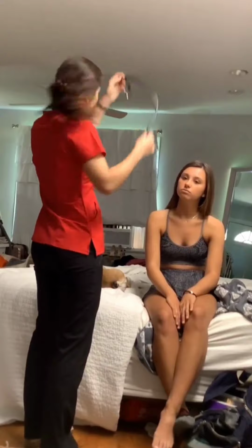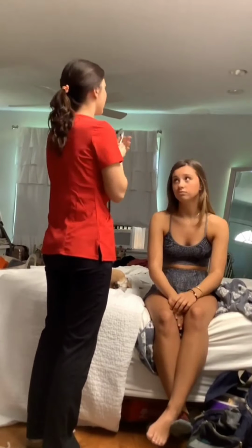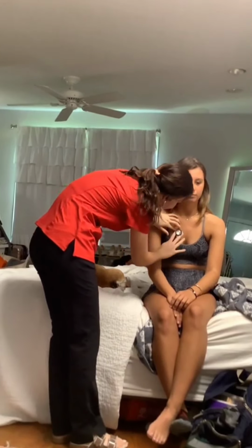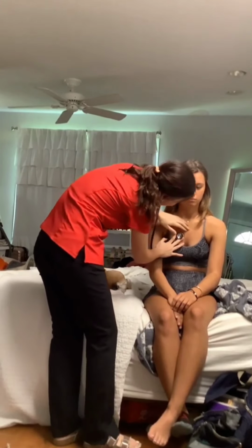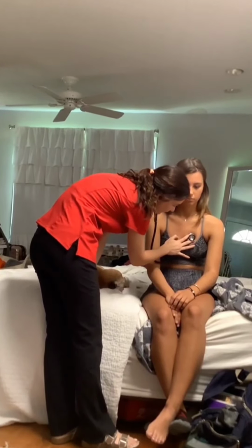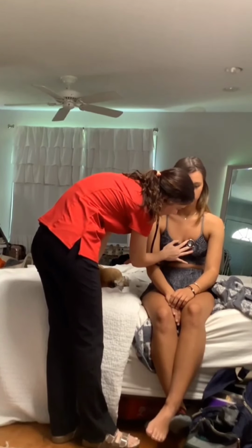So I'm going to clean my stethoscope again, and I'm going to start at the aortic area in the 2nd intercostal space to the right. And then right across to the left in the 2nd intercostal space, the pulmonic. And in the 3rd intercostal space underneath on the left, Erb's point.